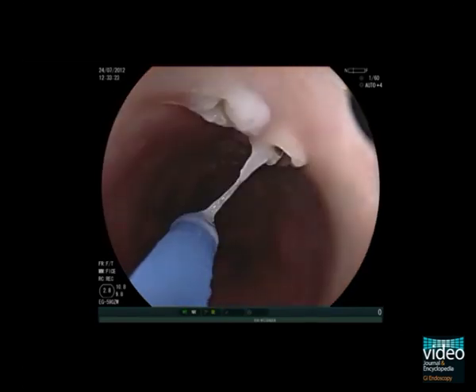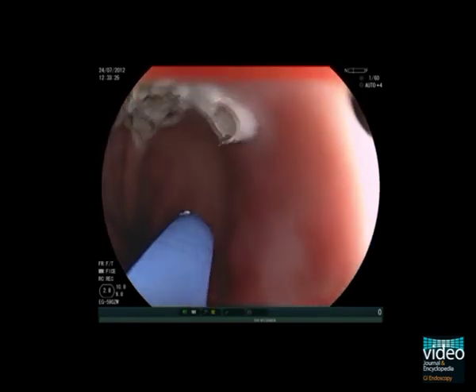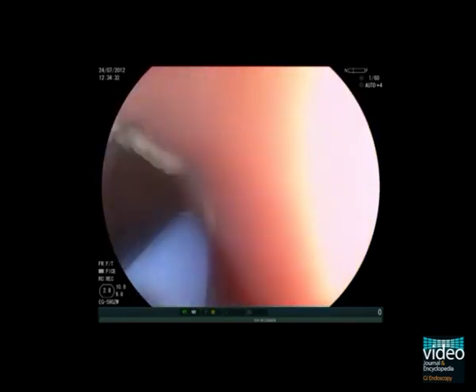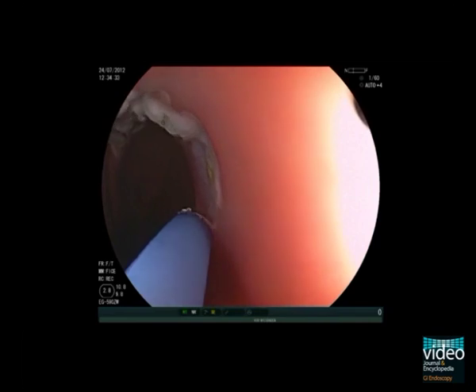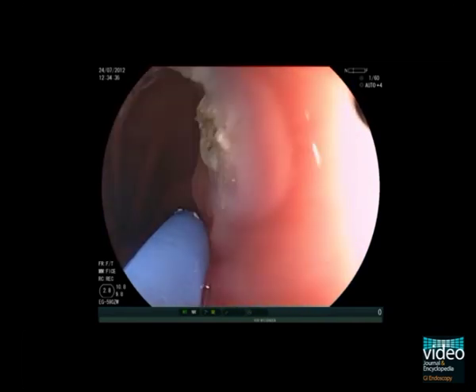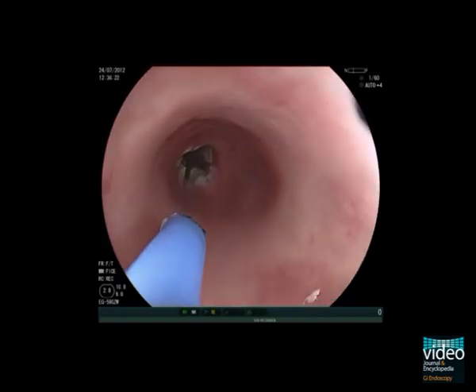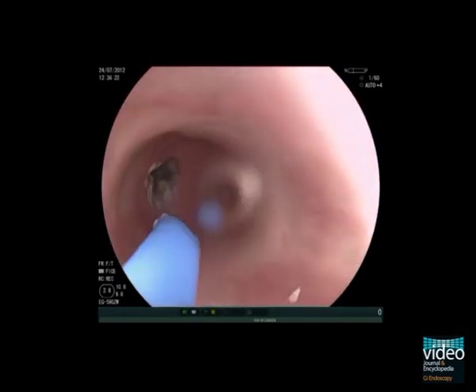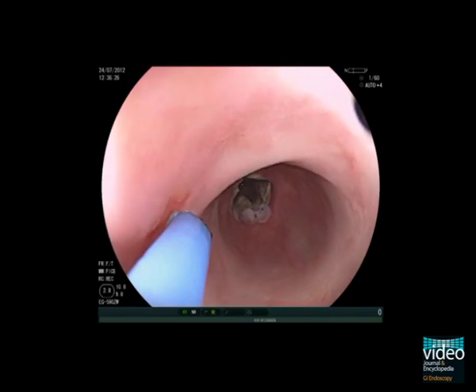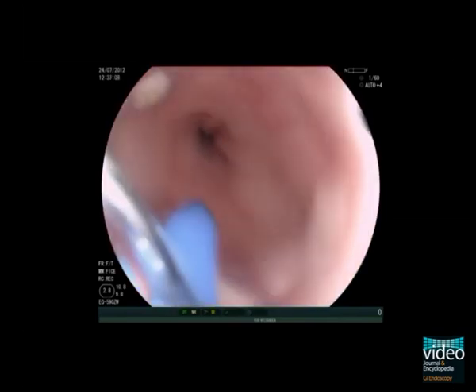After a flexible APC probe has been introduced via the working channel of the endoscope, the Barrett's mucosa is ablated dynamically using a wattage of 50. Finally, tiny islands of Barrett's mucosa are ablated in the tubular esophagus.